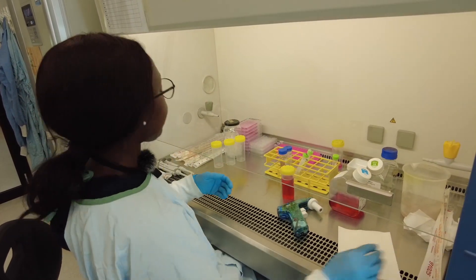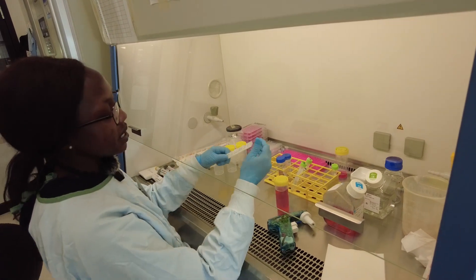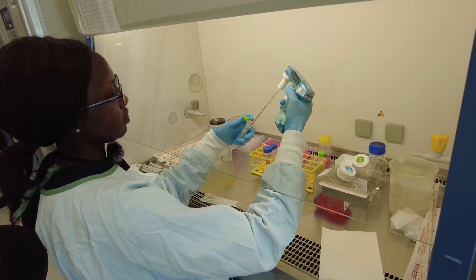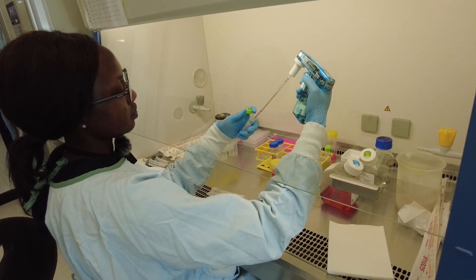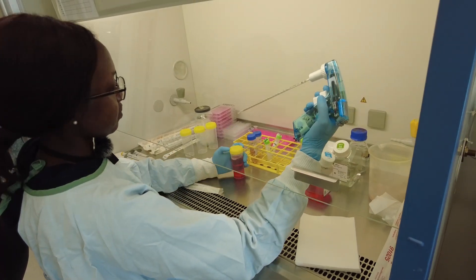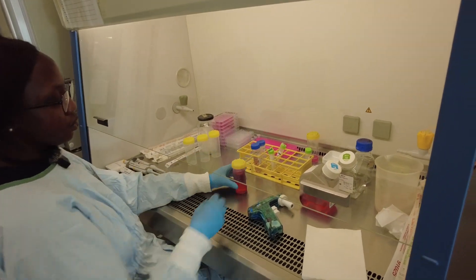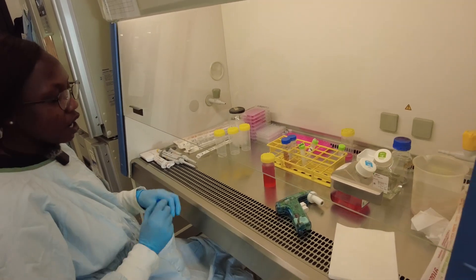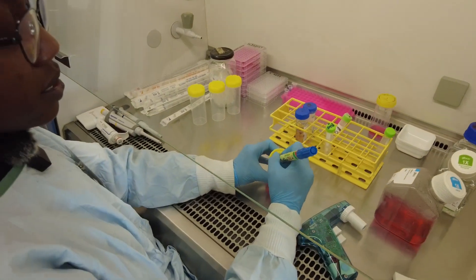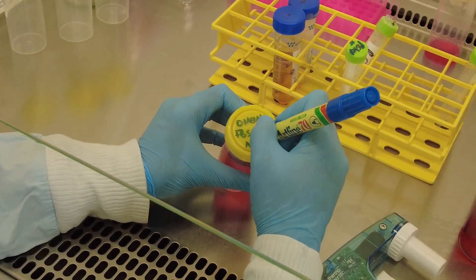Now we need the final 1 ml of our antibiotic, which is streptomycin. So I'm going to add 1 ml. That's it. Now we give it a good mix and then we label our bottle as DMEM and whatever else we put in there — so DMEM, FBS, and penicillin streptomycin, and the date.